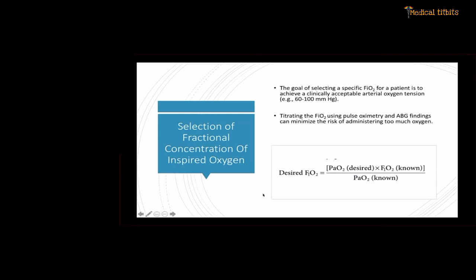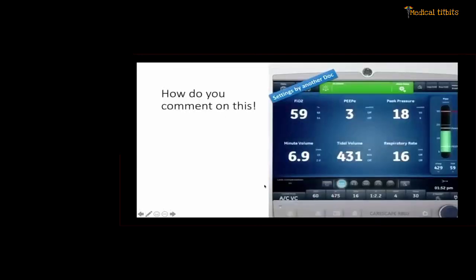Okay. So your idea is to reduce the FiO2 as much as possible, but definitely during your airway manipulation and disconnections, you make sure you give additional FiO2, especially when you are doing procedures like endotracheal tube suctioning.